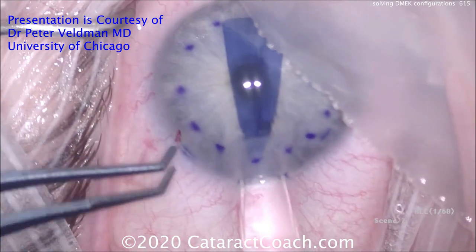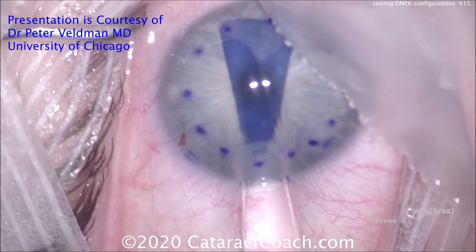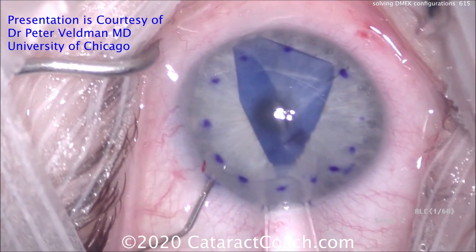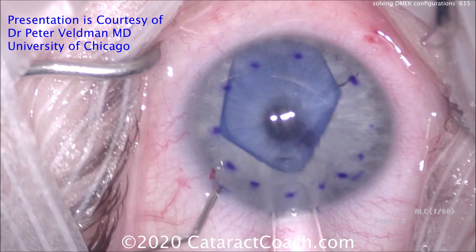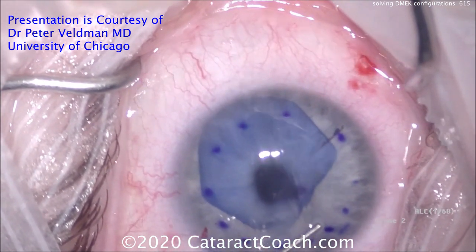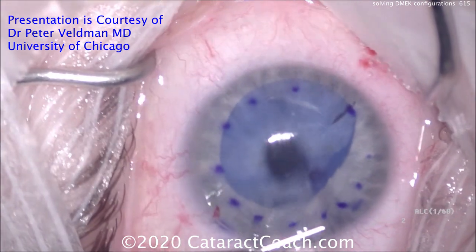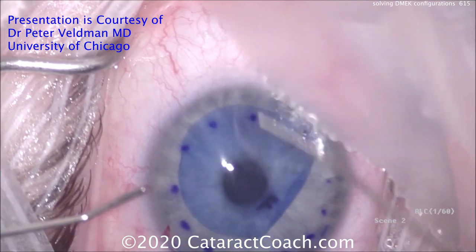Now the graft is going in the eye — it already looks darn good. Releasing some balanced salt solution from the paracentesis. Now it's important to hold the Jones tube at the incision; if you don't and you flatten out that incision, you may get the graft shooting right out of the incision and outside the anterior chamber — you don't want that. So holding the graft there, just a light tapping motion. The catch is you've got to be a skilled surgeon for this, because your right hand is tied up holding the Jones tube and only the left hand is doing all the manipulation. But you can really get the graft nicely unfolded with gentle tapping. Once it's in good position and you're happy with it, keep the anterior chamber flat — let's release some fluid and now pull out the Jones tube. The graft unrolls, and that was a beautiful case.